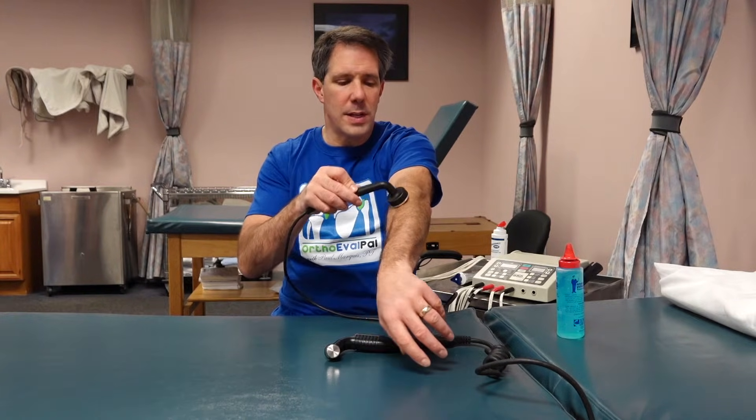Consider what you're trying to achieve. If you want to increase tissue elasticity and blood flow, consider stretching the tissue while you're doing the ultrasound, because tissue temperature will decrease about three minutes after you finish. For example, with plantar fasciitis I like to stretch the patient into dorsiflexion and extend the toes to stretch that fascia during the ultrasound. Maybe I'm stretching the Achilles or the extensor mechanism — heating it, bringing blood flow to it, and stretching all at the same time.